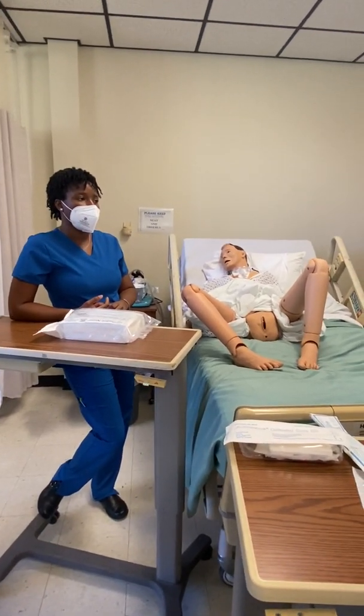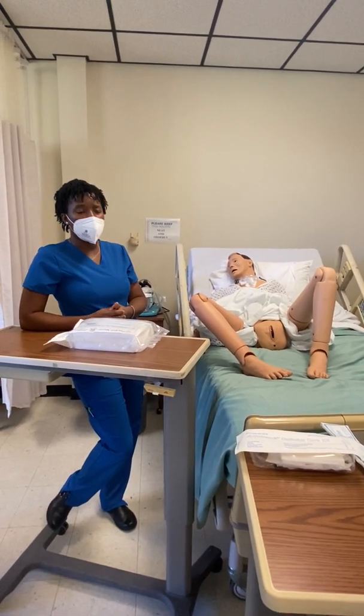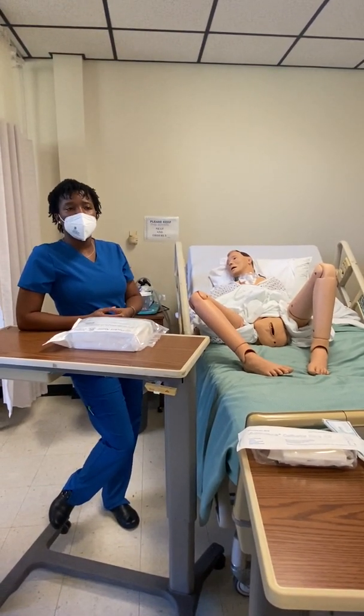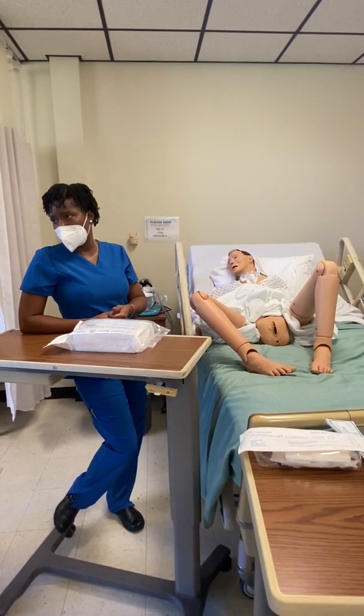So we should do that one maybe right before you get ready to insert. What are we looking for? Where are we about to insert something? The urethra. So what if the vagina is nasty and it's just nasty there? Urethra is nasty, perineal care.